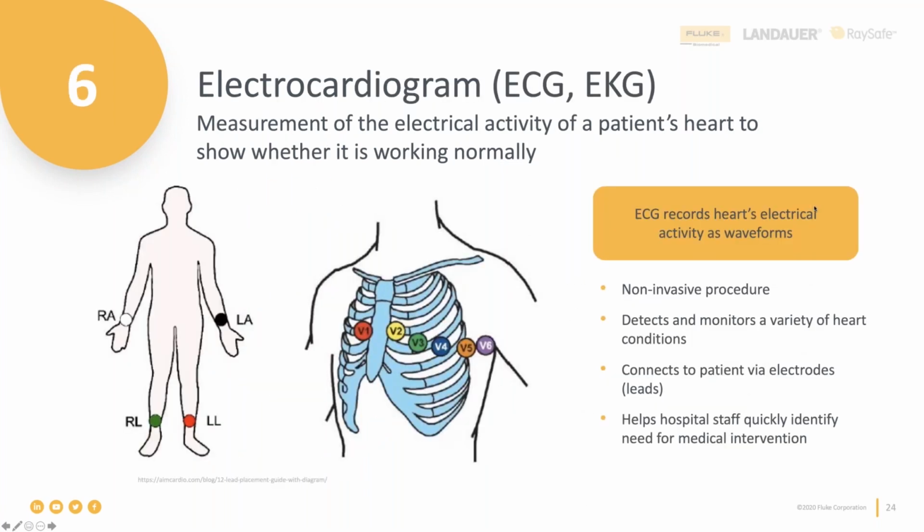All right, now let's talk ECGs. Electrocardiogram, or ECG, also known as EKG, is a reading that assesses the size and direction of electrical currents in a human heart. Electrocardiograms are used to detect and survey a really wide variety of heart conditions in a patient. In ICU settings, ECGs are generally used for continuous monitoring of the patient's heart rate and the detection of any potential fatal cardiac abnormalities.